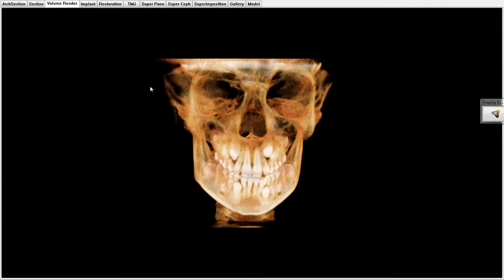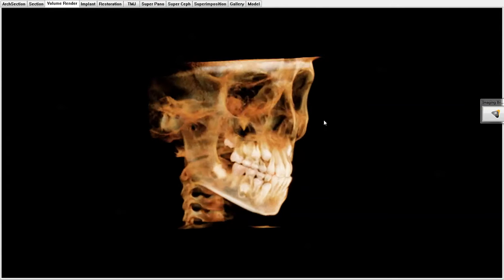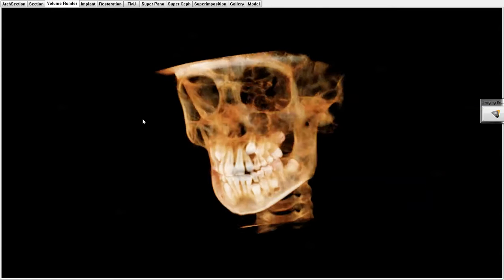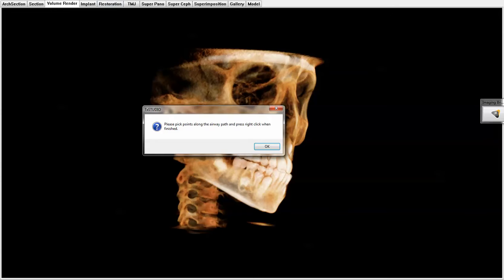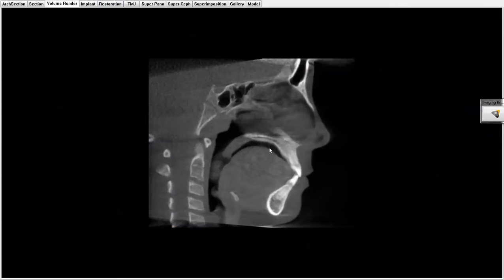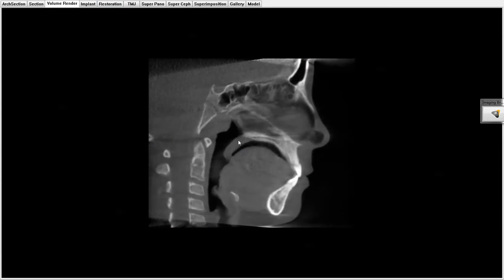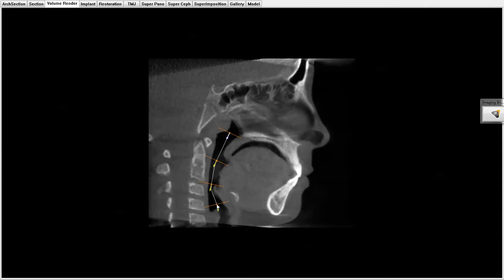My favorite tab is this one right here where I can actually see everything in the 3D dimension. The best part about this one is I can do an actual measurement of the airway — and because you can see right here, this is the exact picture I just showed you earlier with the enlarged adenoid tissues.